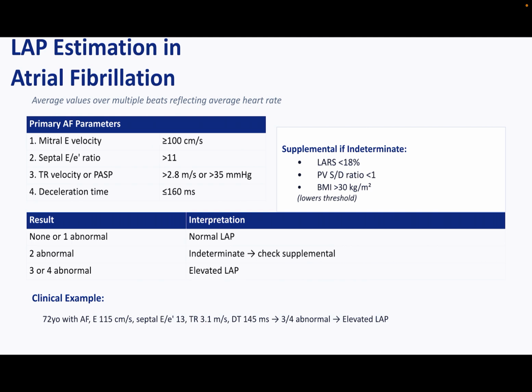Left atrial pressure estimation in atrial fibrillation. Atrial fibrillation eliminates the A wave, the atrial kick is gone. This means the E to A ratio is meaningless. E to E prime still works, but must be averaged over multiple beats. TR velocity still works, but needs averaging.